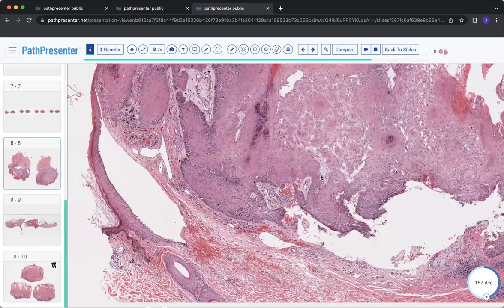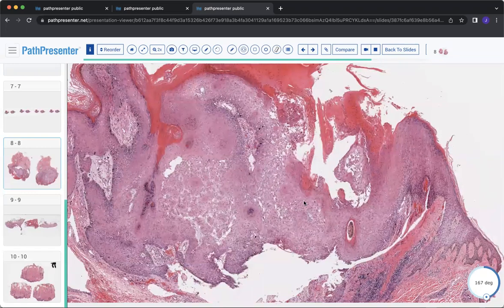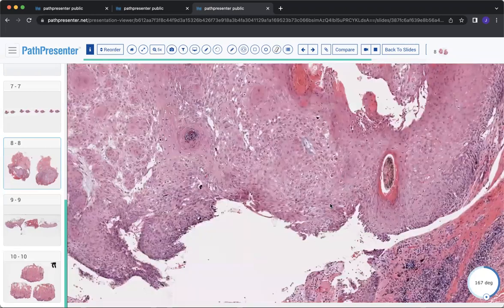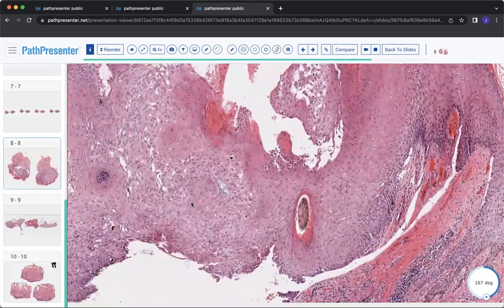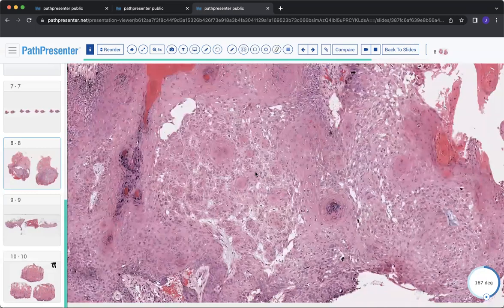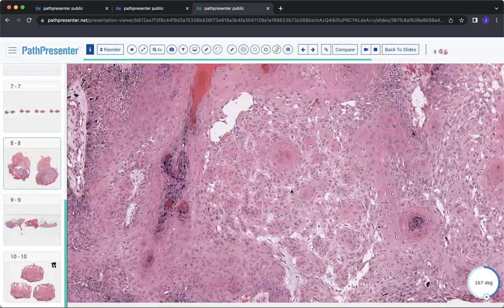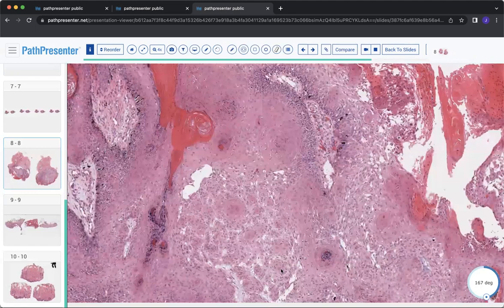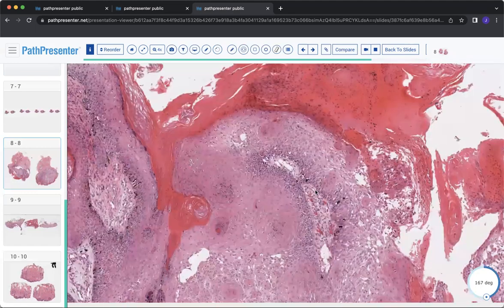Definitely, because it's important to just do a BRAF V600E and show it's negative, and maybe a CD34 to highlight some areas where if you do see convincing CD34 staining, that can help push you more towards a trichilemmoma versus inverted follicular keratosis. So this is more of a real world specimen here, where you can see it can be somewhat difficult sometimes to really classify these if there's a lot of secondary trauma to the lesion.